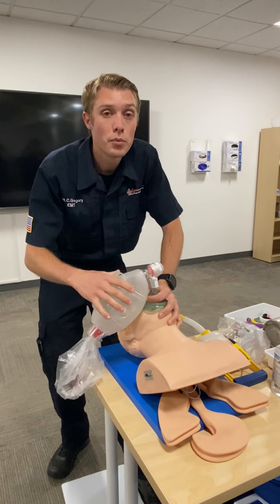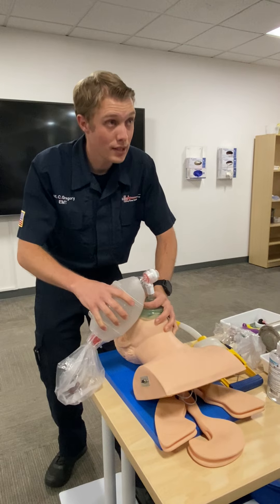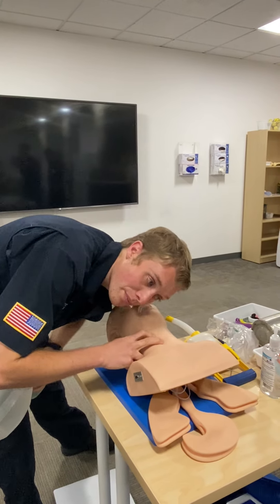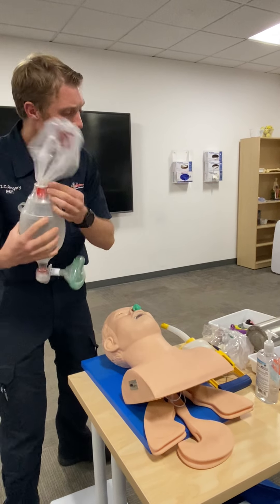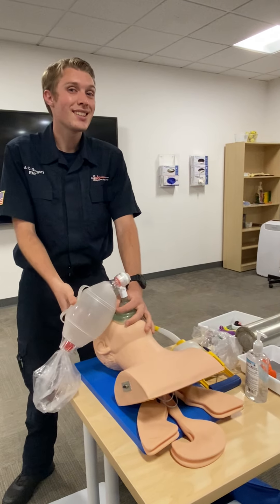For this patient, I'm going to keep breathing for them until the two-minute mark. At two minutes, it's time to reassess — stop, feel for pulse and breathing. I still feel a pulse, about one per second, and there is still no breathing. At this point, I'm going to connect the BVM to oxygen and resume ventilations. And that's the skills test.